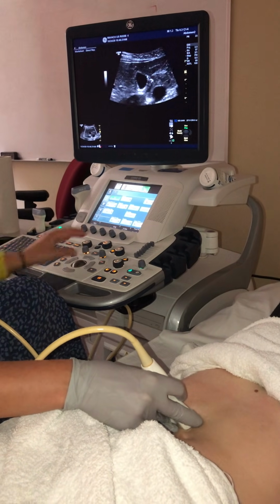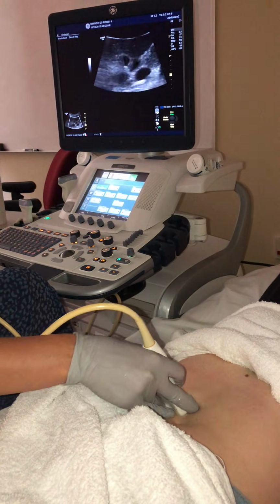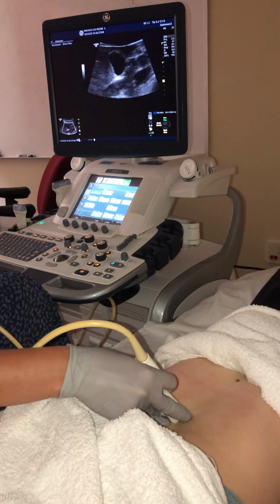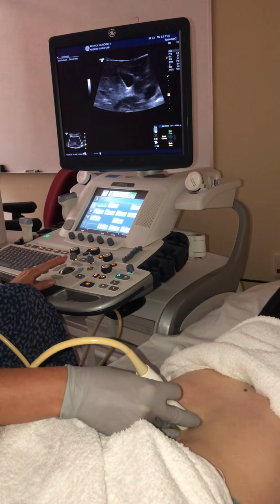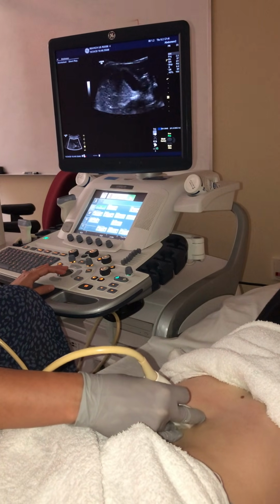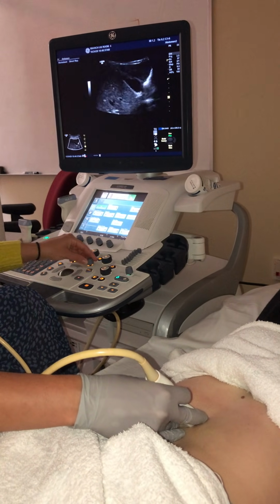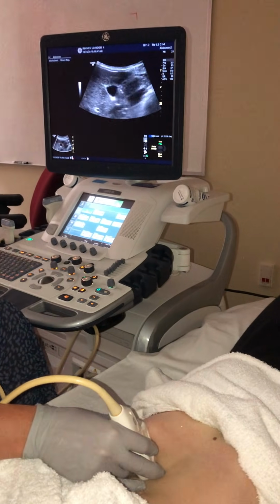Now when we're looking at the gallbladder, we also want to be looking for our common bile duct. We know that that is going to empty out the gallbladder and it's going to go on to travel into the duodenum after it meets with the pancreatic duct. So it's pretty important. And we're going to stay in the same position, but it's a little bit more tricky to find. So you're going to have to search around for a little bit for a second.